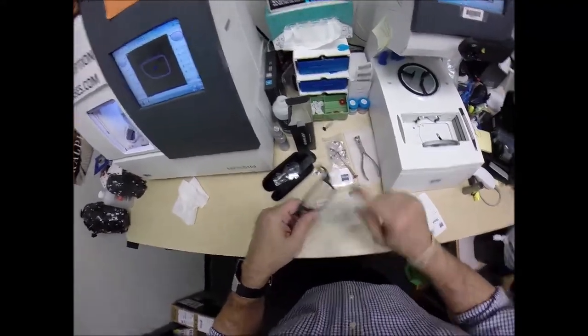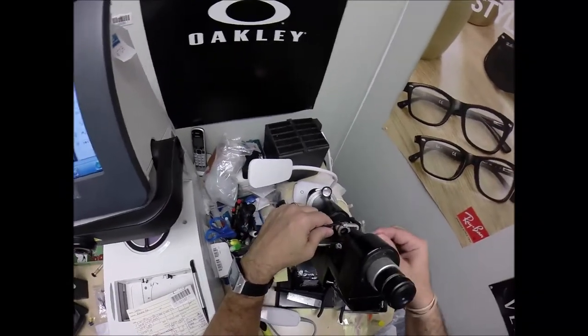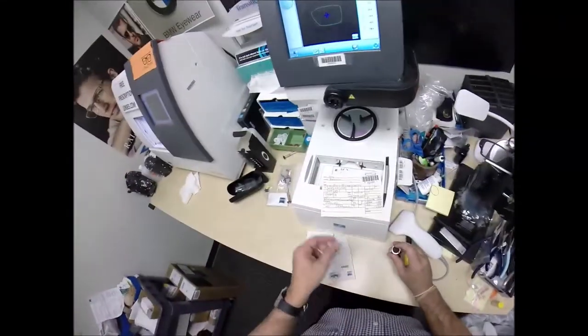I'm going to put it in above that black dot, and if all goes well I'm going to get a plus 50. I don't have to move the axis wheel — there is no astigmatism correction. Plus 50, exactly halfway between 0 and 1.